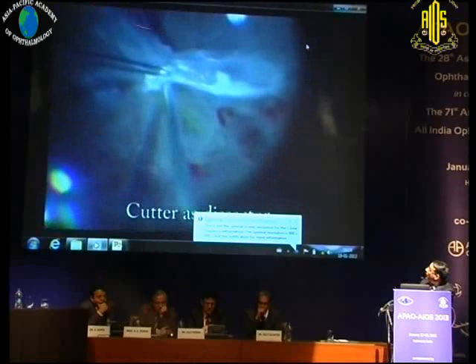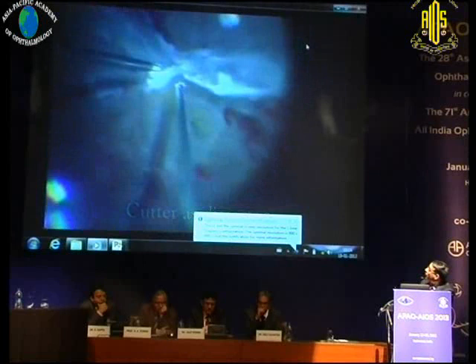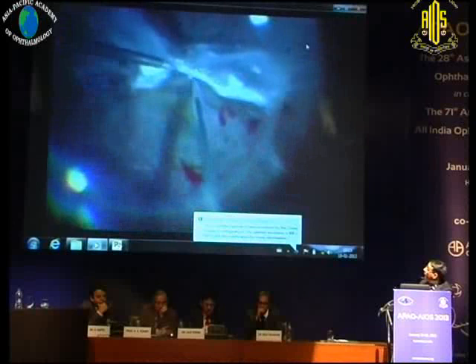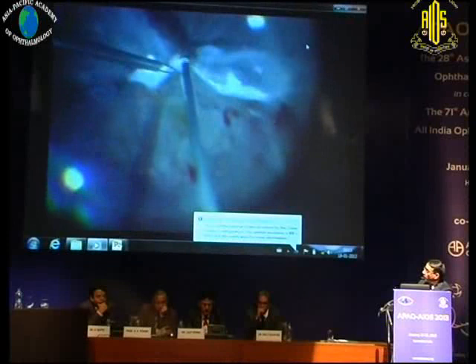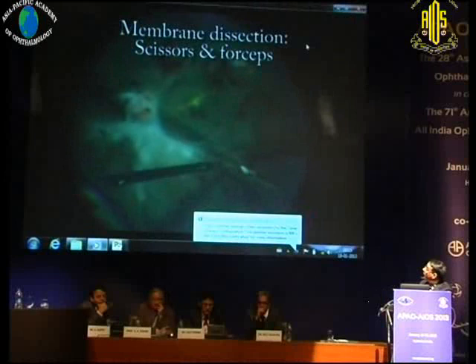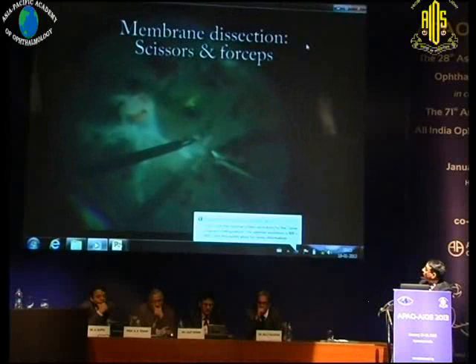When working bimanually in these large traction detachments with large fibrotic membranes, you can use the cutter as a second instrument to both separate the membrane and cut it. That's where MIVS — the micro-incision vitrectomy system — has made it simpler. With 23- or 25-gauge, we're now doing these cases with 25-gauge cutters. It's more about the tissue planes than the size of the cutter.